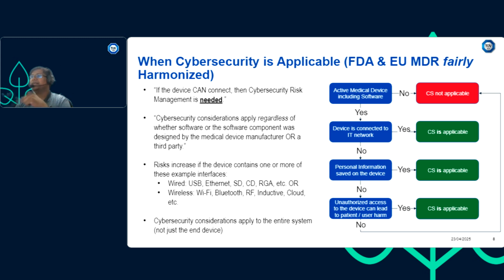Okay, it's not connected, it's not storing any information, but is unauthorized access to this device possible, which can further lead to patient harm or user harm? If that is the case, then cybersecurity is applicable.